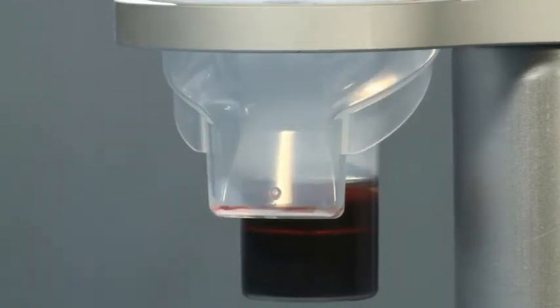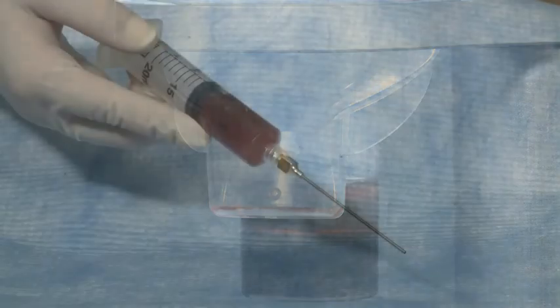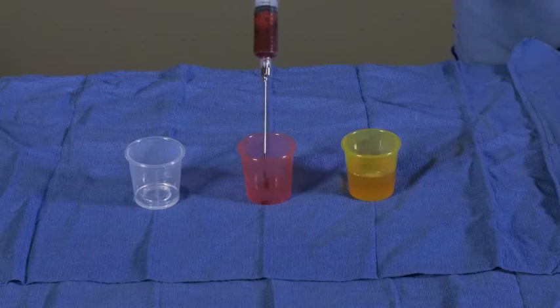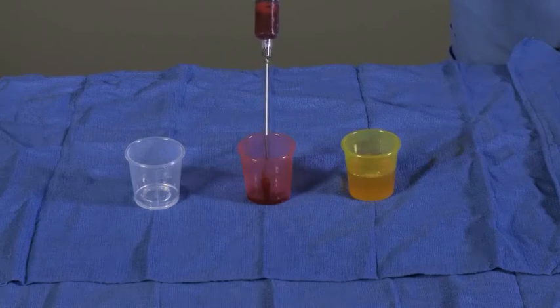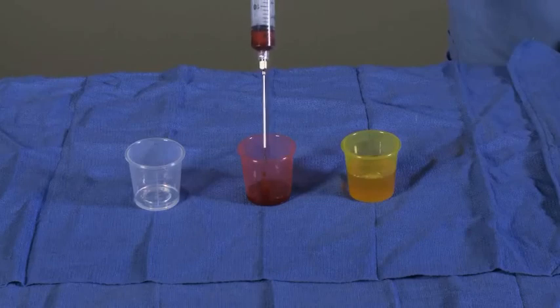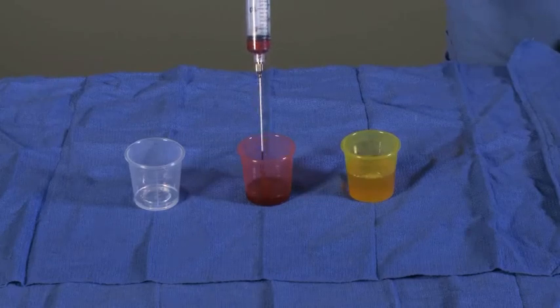Withdraw the total volume of the platelet concentrate into the syringe. Look at the base of the plasma chamber to confirm that all the platelets have been re-suspended and withdrawn into the platelet concentrate syringe. For sterile technique, transfer the recovered platelet concentrate into the red cup located on the surgical field by slowly expressing the platelet concentrate from the syringe. Avoid excessive force when transferring the platelet concentrate.